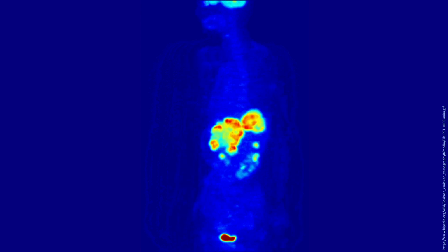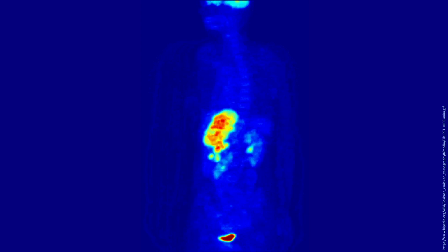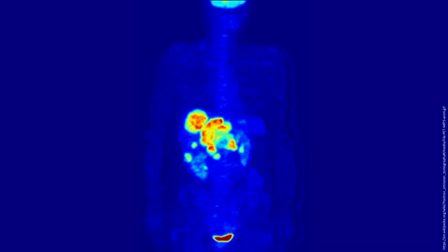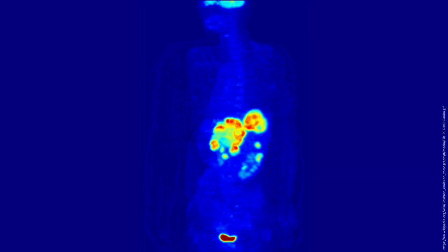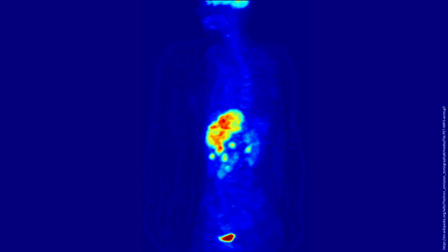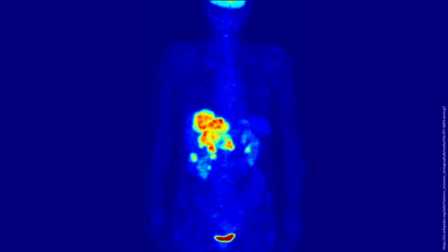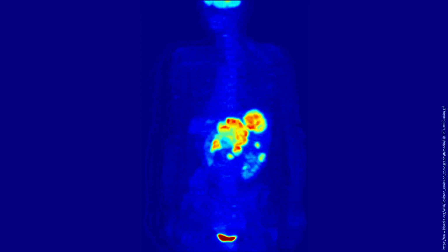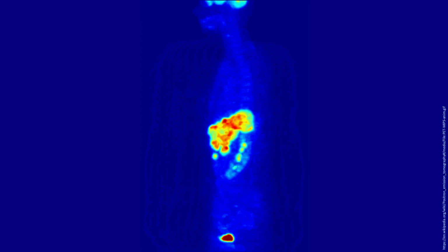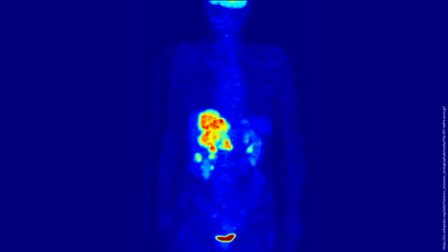This is a full-body PET scan of a woman where the tracer FDG was used. According to Wikipedia, this scan shows a large metastatic tumor mass in the liver from colon cancer. This can be seen by the red spots within the abdominal region of the scan. The radioactive urine in the bladder means that the body has already started to break down the tracer. That is why the bladder appears red on the scan. The bladder, kidneys, and brain are accumulating the tracer normally.